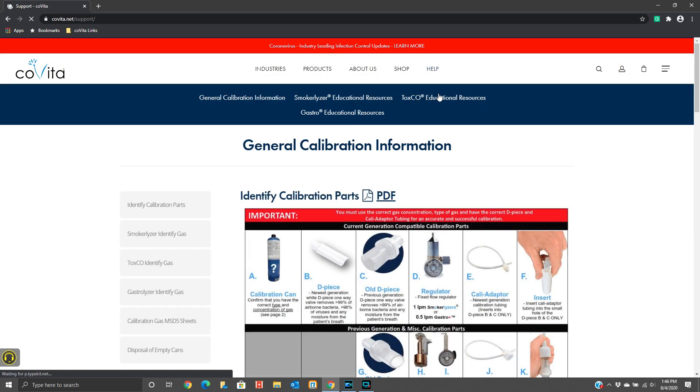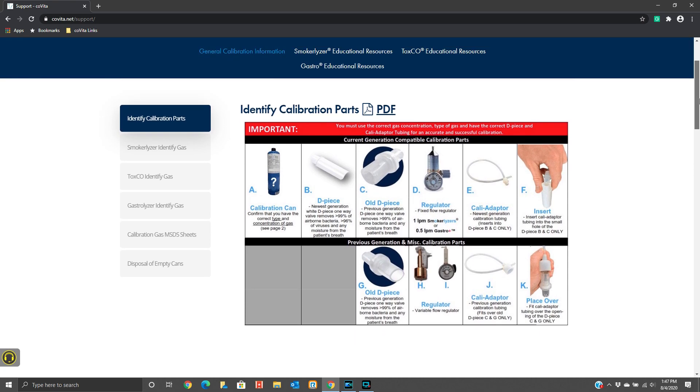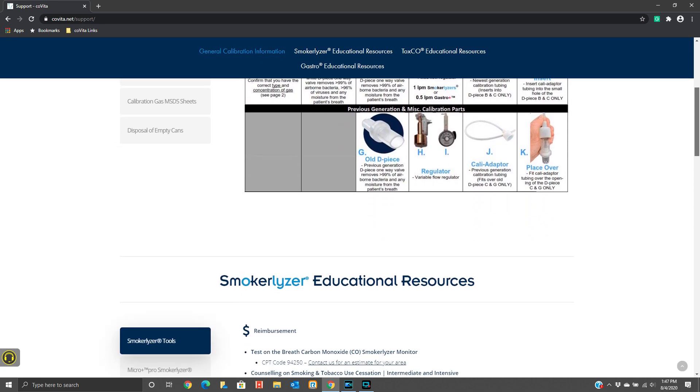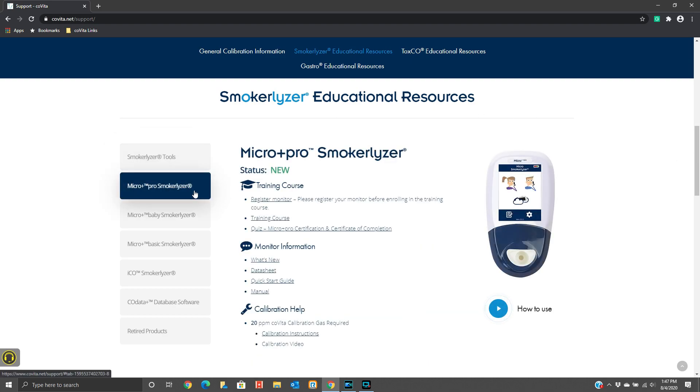Once in the Help section, you will see General Calibration Information. As you scroll down, you will see Smokerlyzer Educational Resources. On the left side of your screen, you can select your Smokerlyzer monitor to find material on training courses, monitor information, and calibration help.